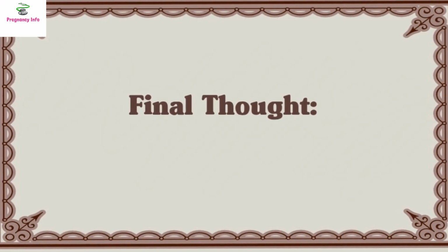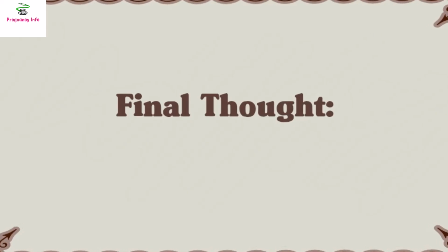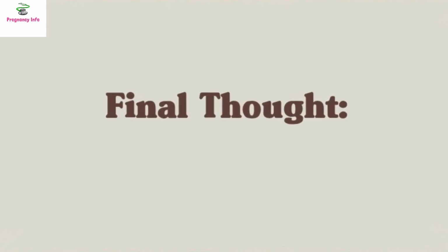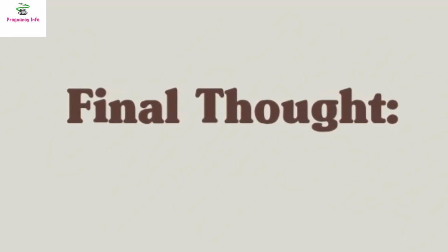Final thoughts. Home pregnancy tests are a great first step toward finding out if you are expecting, but always confirm your results with a healthcare provider through a blood test or ultrasound. If you are unsure or still have symptoms, retesting after a few days is a good idea.